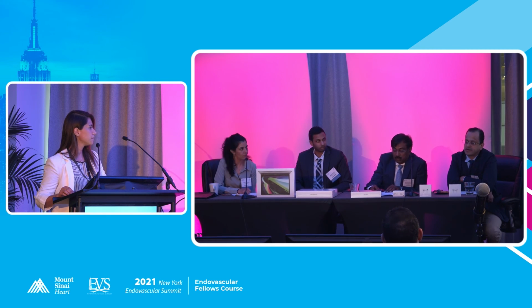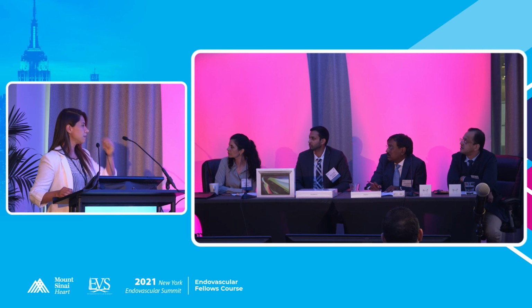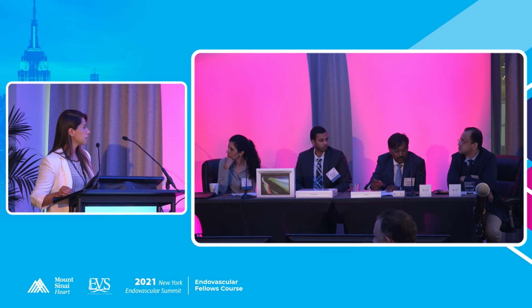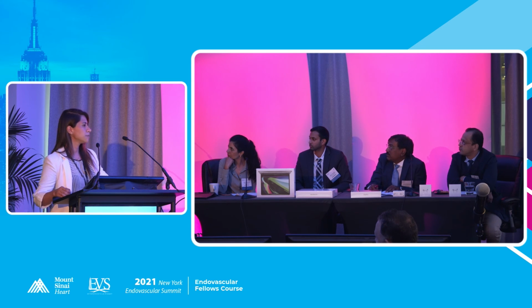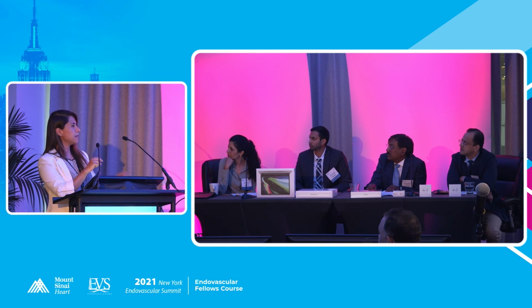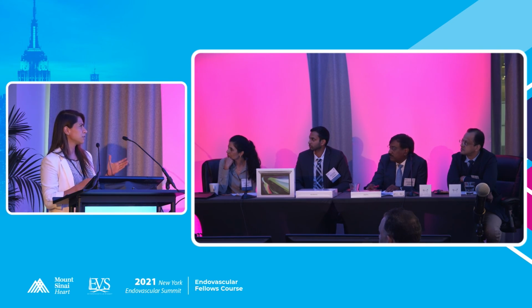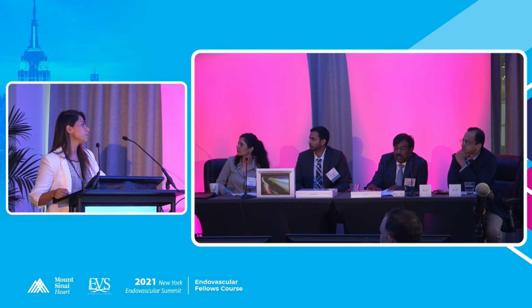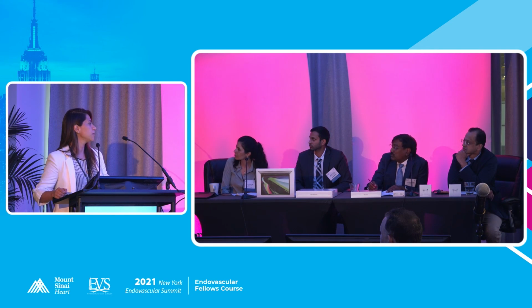So what made you pick translumbar as opposed to transarterial, or even now the newer one they do, transcaval? Why did you pick transabdominal? Transabdominal was because we saw in the angiotomography that the distance between the wall and the sac in this thin person was approximately 5 centimeters, and translumbar was more like 15 centimeters, and we didn't see anything between the wall and the sac, so we decided to do that. That was the reason. We had an experience before and it was very good with the patient too.